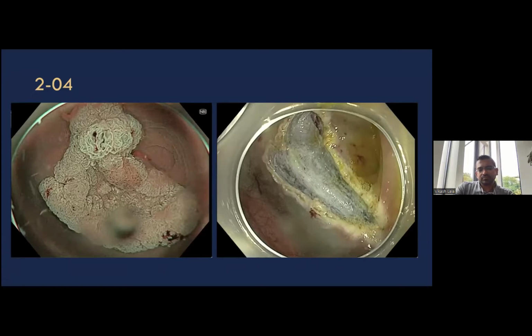Question number 2. Yeah, I mean, underwater imaging is beautiful. You don't necessarily have to do it, because it's not necessary to use these classification systems, nor is the beautiful imaging that we are lucky enough to have on our scopes. But I think it does help to demonstrate the possibilities. So I do use it. I don't think you have to use it to get into these classification systems, but yeah, I think it really can help.